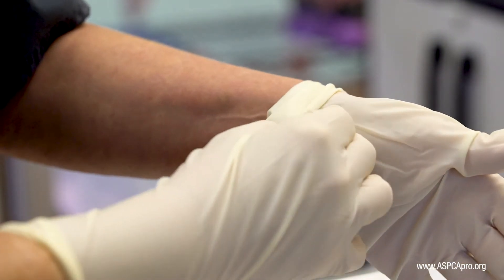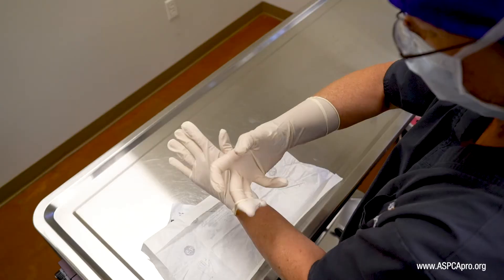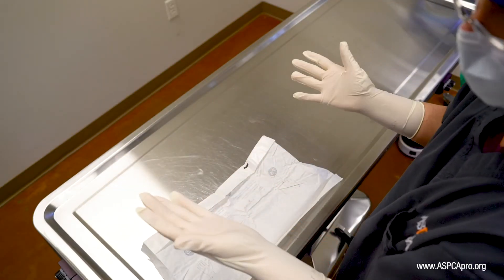Finally, use your second hand to carefully pick up the sterile aspect of the fold on the first glove, and adjust it to eliminate the fold.